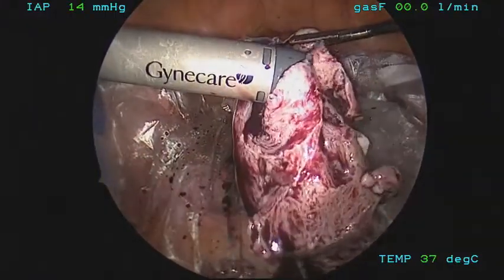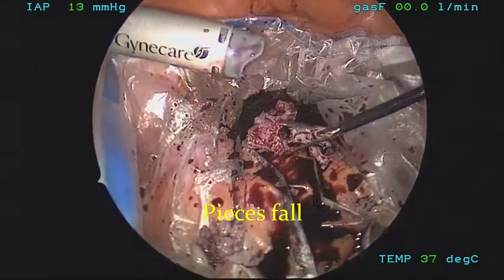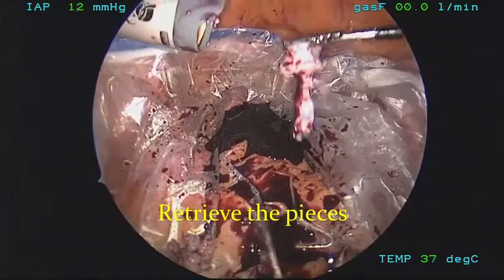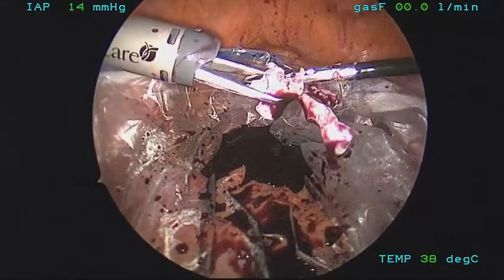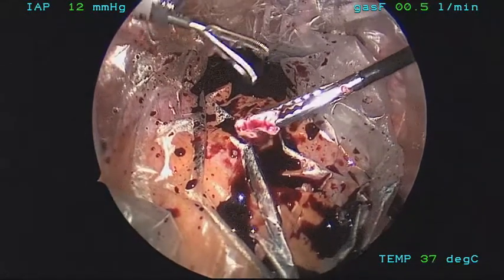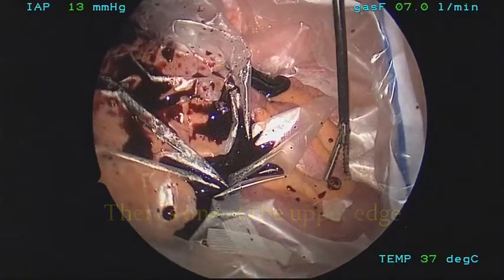The plastic bag helps keep the bowel out of the reach of the grasper. Of course, any surgeon can grab the bag, but this is part of good surgical technique. Now with the smaller pieces, you try to pull them through without spinning. If you need to, turn on the morcellator just momentarily. At the end, we will suction all the fluid and pick up all the different pieces, even though it's inside a bag. Now you can see that small pieces have eventually fallen and are contained inside the bag.